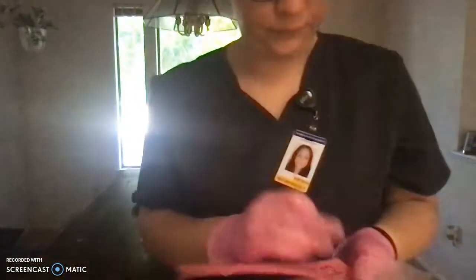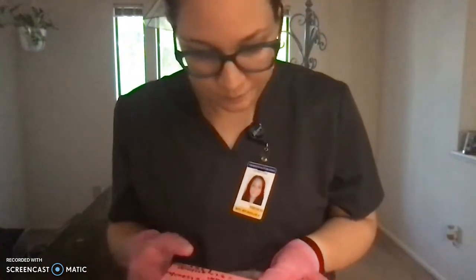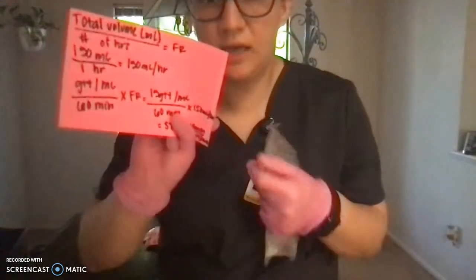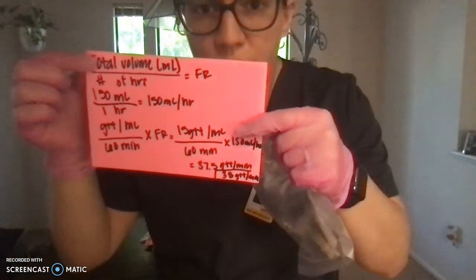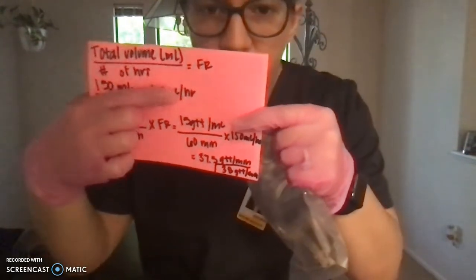First, you always want to clarify your orders. Our orders are going to be 150 milliliters for 1 hour. How I did that is the total volume in mLs over the number of hours will give you the flow rate.